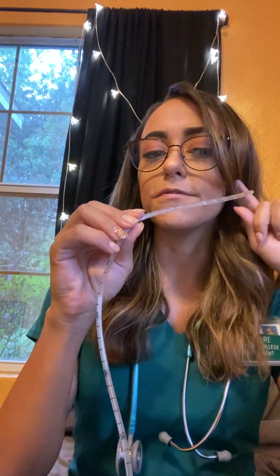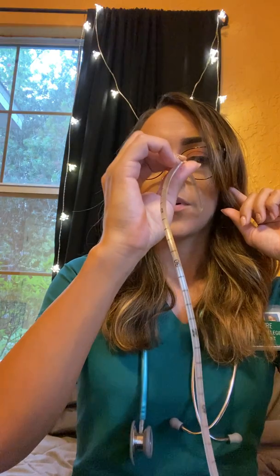Okay, so then after all of that and it does successfully go in, you're going to go past the insertion till you get to the nasopharynx area and rotate it towards the other side, and then you'll be able to go ahead and use your downward pressure to go past the oropharynx. And then at that point, you can tell the patient to put their head down and give them water and have them take sips of water as you continue to advance the tube. You'll advance it every time they take a sip, so the swallow kind of helps take the tube down with it.